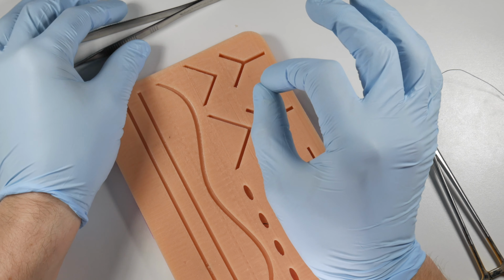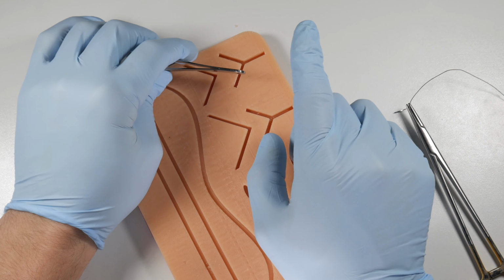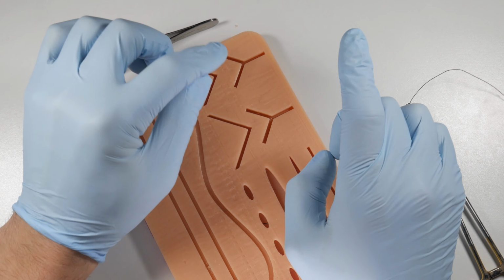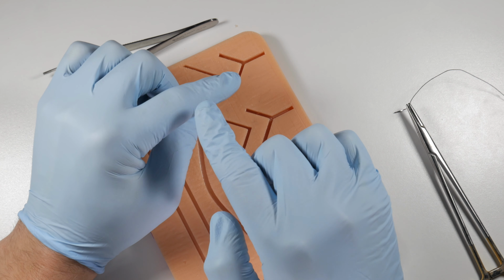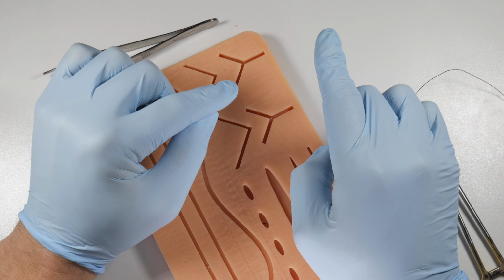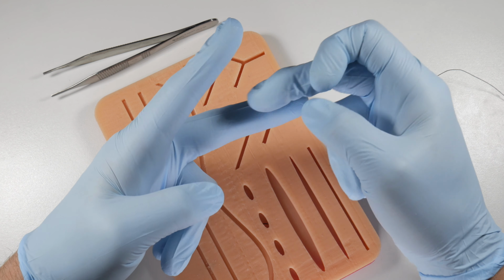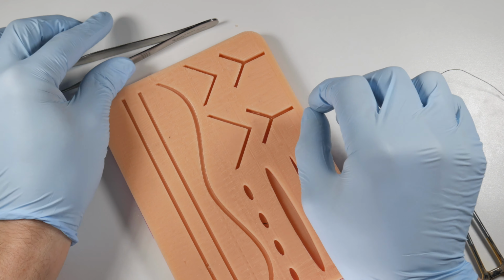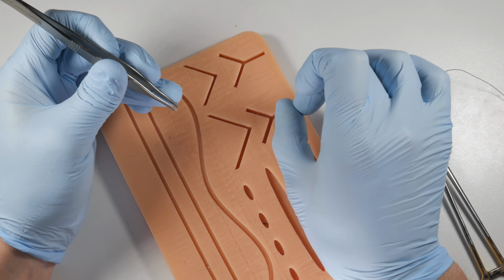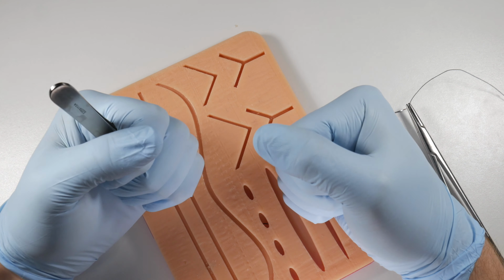Now, one of our options here, instead of a simple interrupted suture, would be to do a vertical mattress suture. Now, there are other choices you could do, but the vertical mattress is really cool because it's essentially like two simple interrupted sutures again with just one knot, and they're both in the same plane. So you get lots of strength there by having basically overlapping sutures tied with a single knot. So not a lot of irritation to the patient because there's that single knot over there, but you've got twice the strength basically in that line of the incision. So you're resisting the muscle pull.